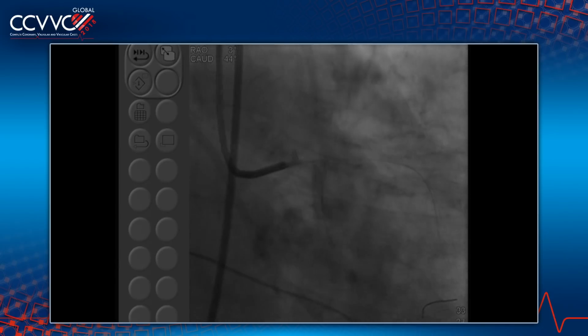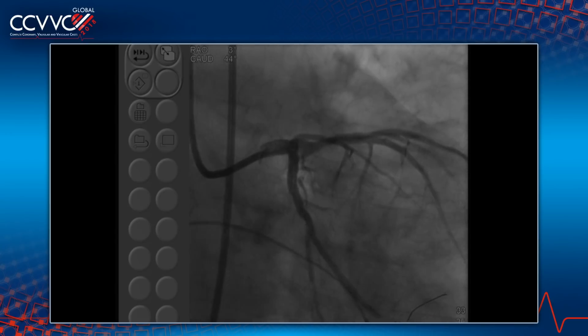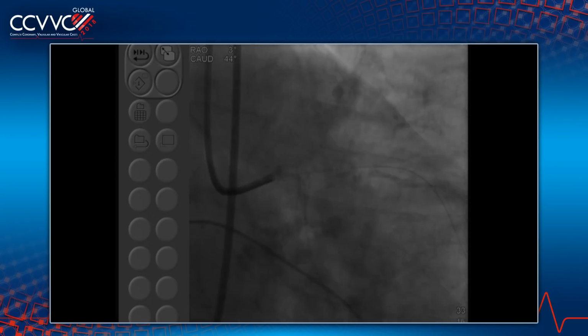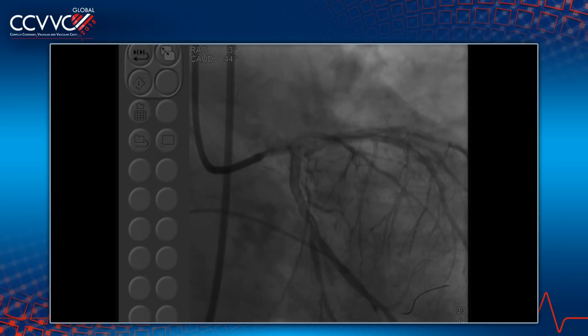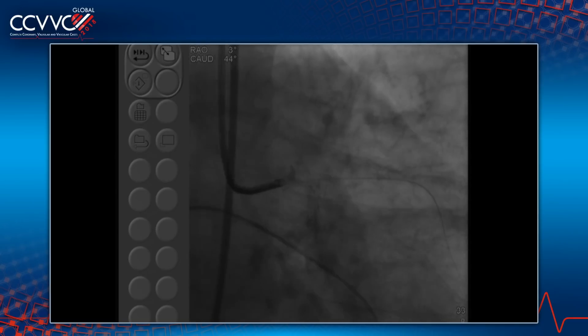We're going to do some IVUS. Everyone wants you to do some IVUS. Do you want to finish your case? What do you want to show there? One of the things that will pop up on the IVUS is that there was such a huge amount of plaque burden.